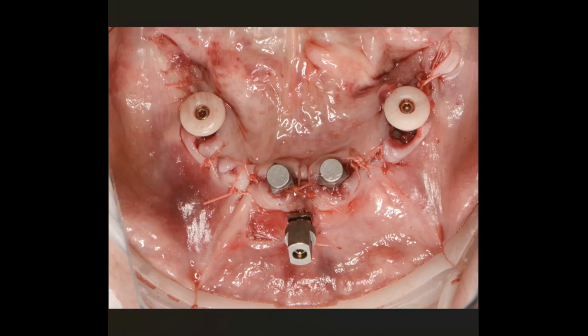So I don't care about what's on 20. People always say, well, are the premucosal abutments on 20 to 29, are they cataloged? Can you align to them? I mean, technically, yes, but they're 3D printed, so they're not going to be totally accurate. But also, if you ever took an exocad class or watched your lab tech work, they cannot perfectly align number 20, number 23, number 26, and number 29. They will never perfectly align. So I just go straight to the midline.